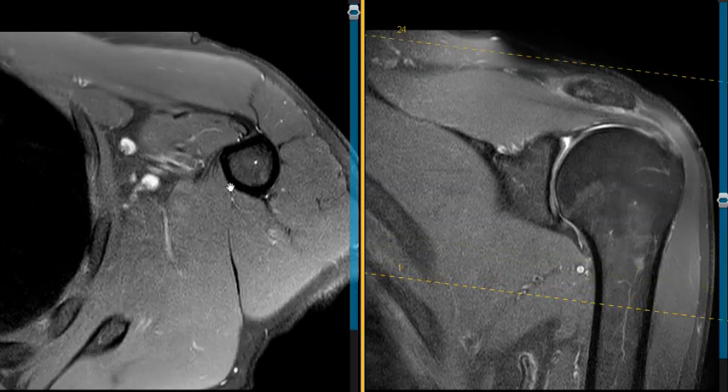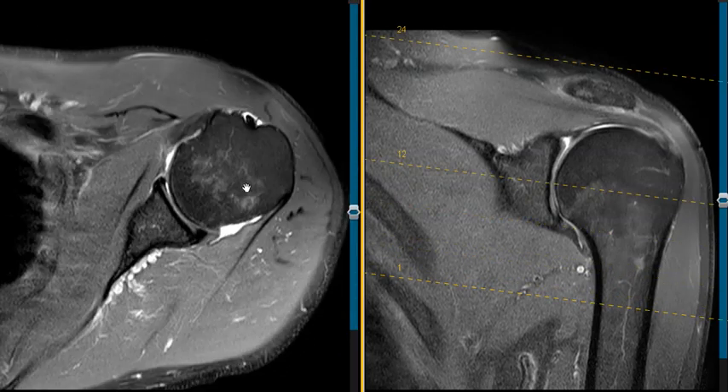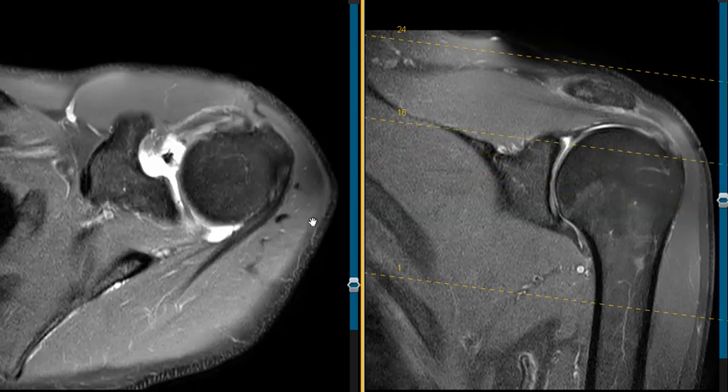We have another view here where we can see the same thing. Going up into the middle of the joint, we're going to see the anterior labrum — that little black triangle; you can see how closely approximated to the bone it is. Here's the posterior labrum, a little triangle, and the anterior labrum.